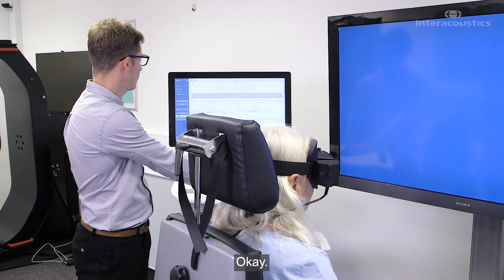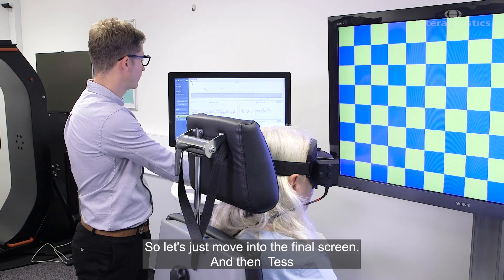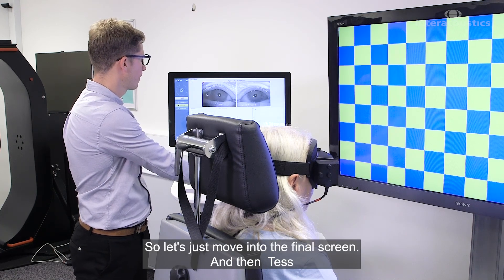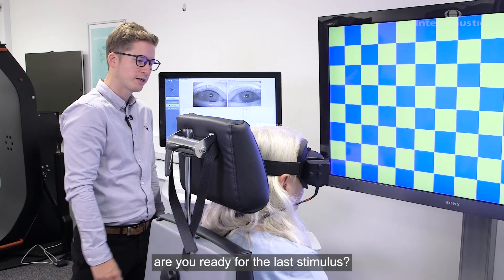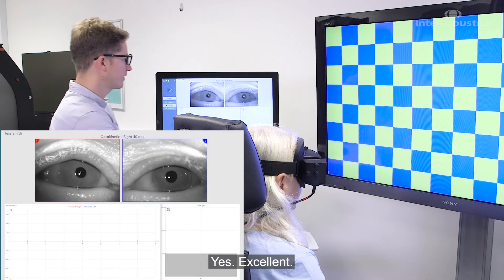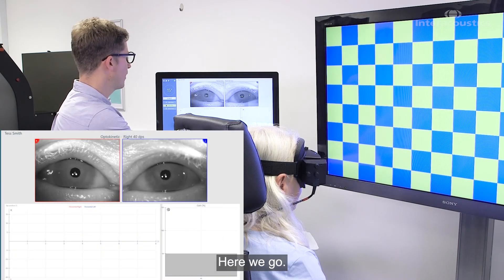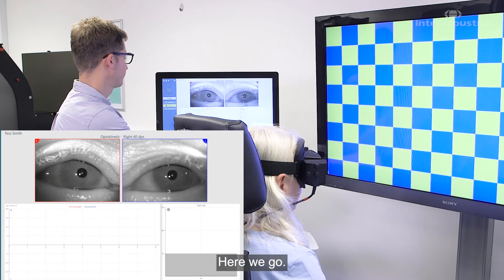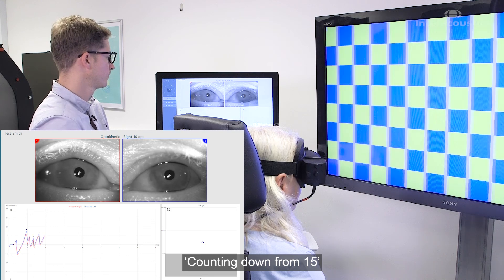Let's move into the final screen. Are you ready for the last stimulus? Excellent — you're doing a great job so far. Here we go, counting down from 15.